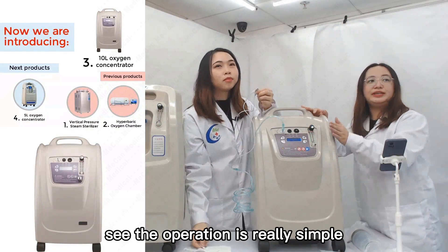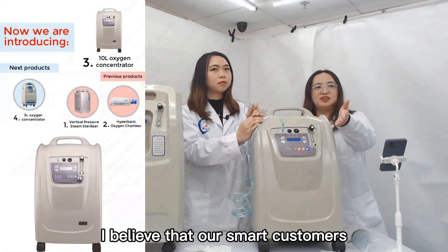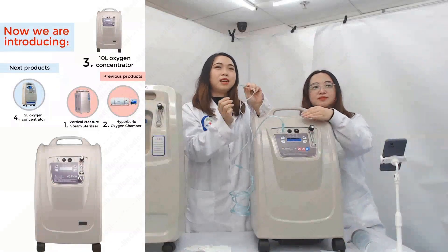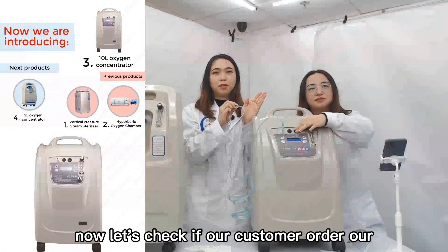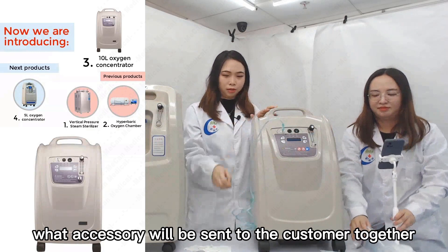The operation is really simple. After watching our presentation, I believe our customers now know how to operate it. Now let's check what accessories will be sent to the customer when they order our 10-liter oxygen concentrator.